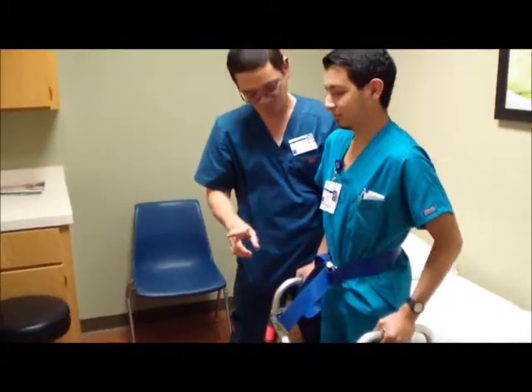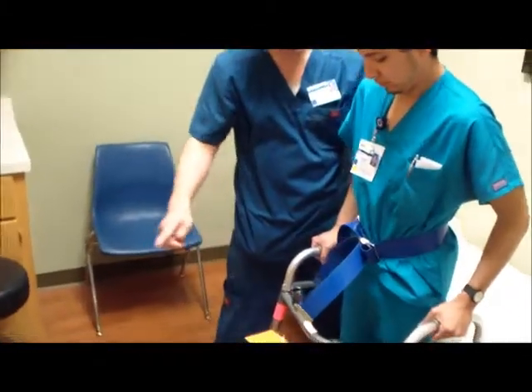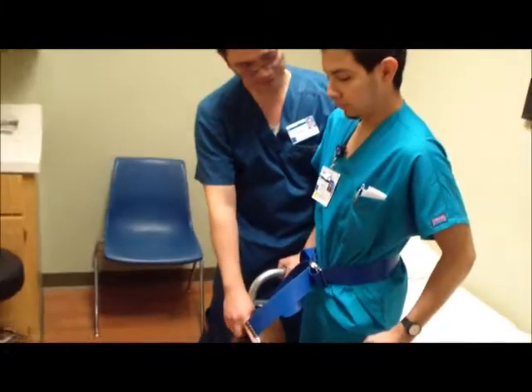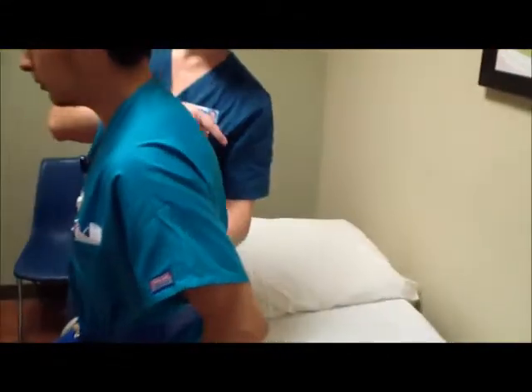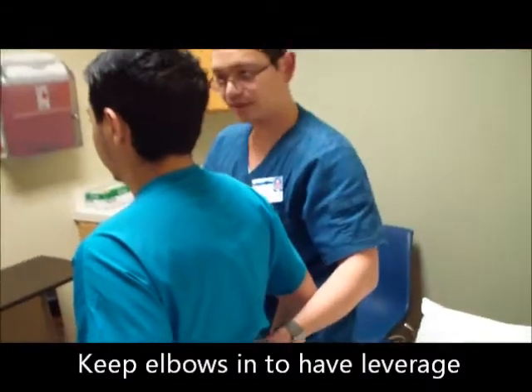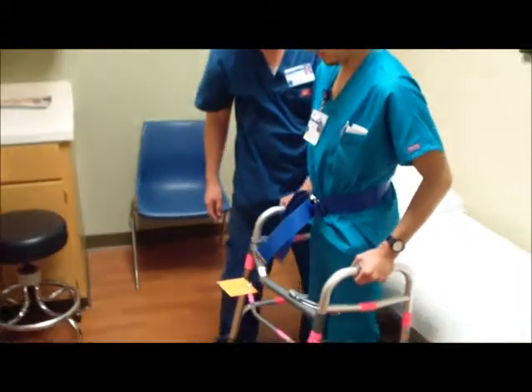Yes. Okay, so when you walk, you want to make sure that you're close to the walker. You don't want to push the walker too far ahead of you, or get too close to the bar here, okay? So when I walk with Matthew, I'm going to keep my elbows close to my body and hold on to the belt really well with my thumb opposed to my fingers, okay? You ready, Matthew? Yes. Okay, let's take a few short steps.